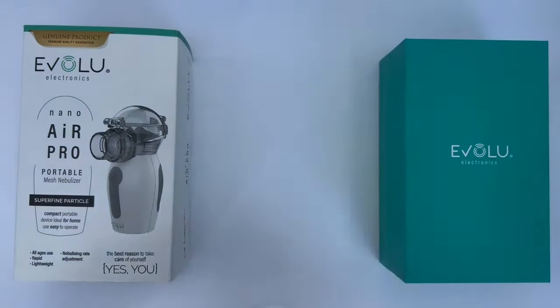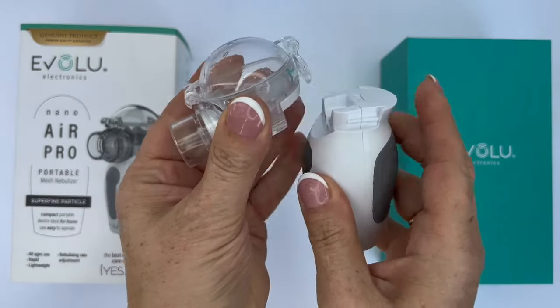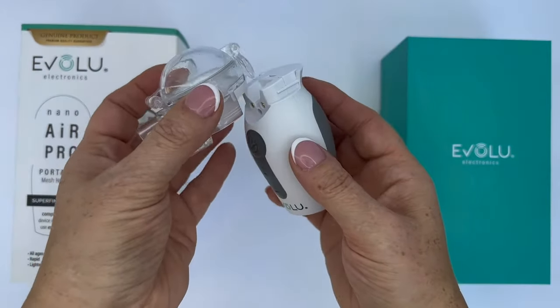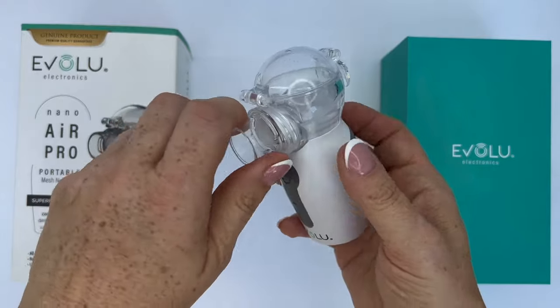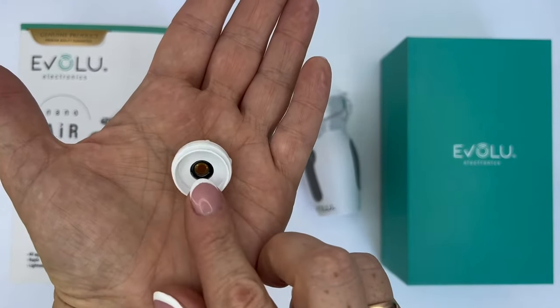The medical cap is easy to install on the device as it has a magnet. The membrane disc can be detached from the cup for more convenient cleaning and disinfection. However, under no circumstances touch the center of the disc.